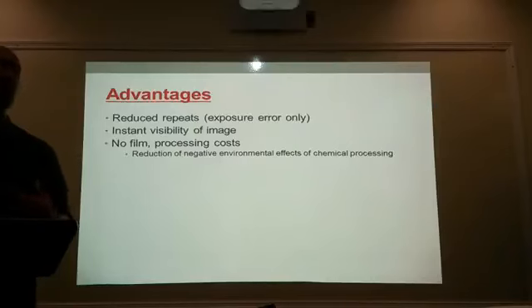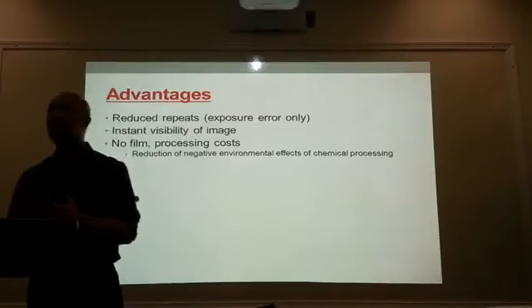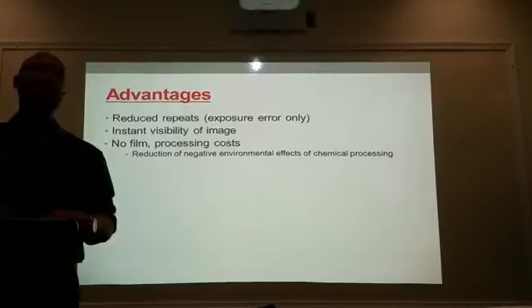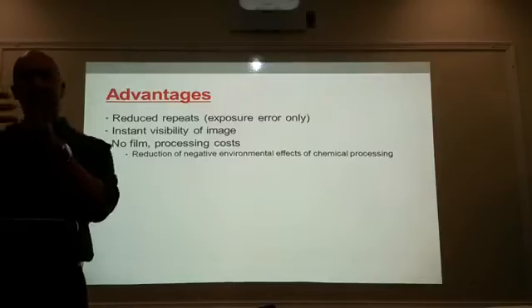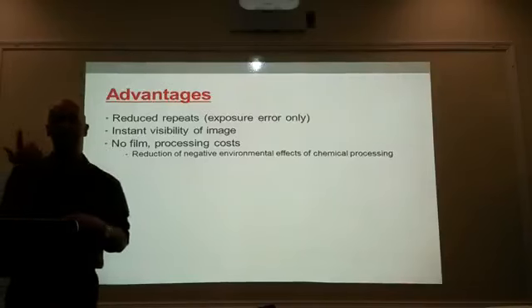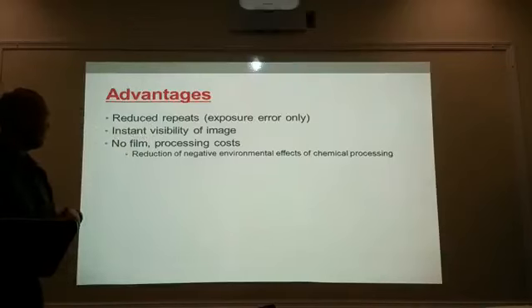We're three-dimensional, and when you come into the program, we're going to teach you the proper way to position your patients for the procedure. Because we're three-dimensional, you've got to angle that body part just right to look at that specific anatomy. And even then, we can still get errors. Okay? But it eliminates the exposure errors.